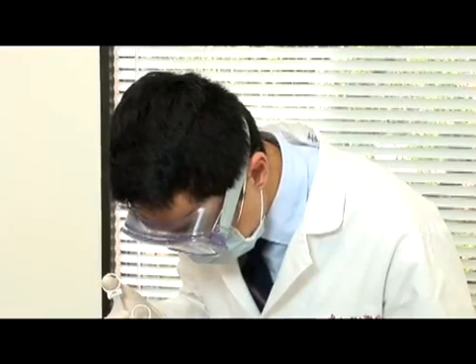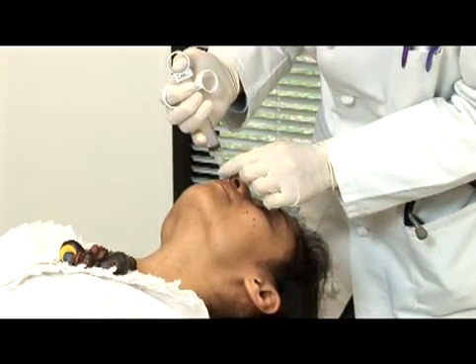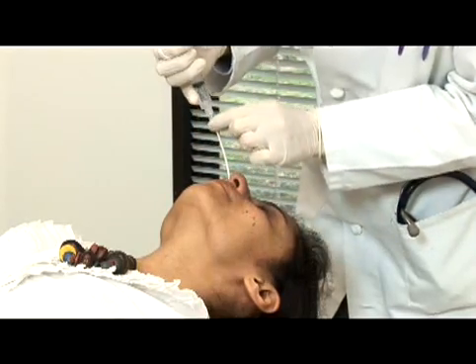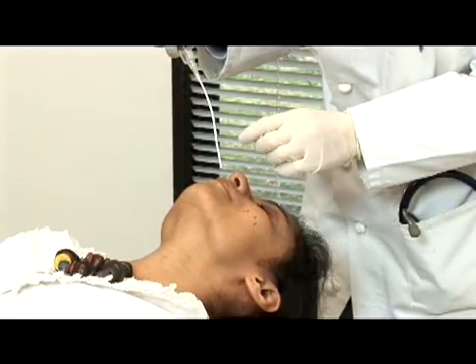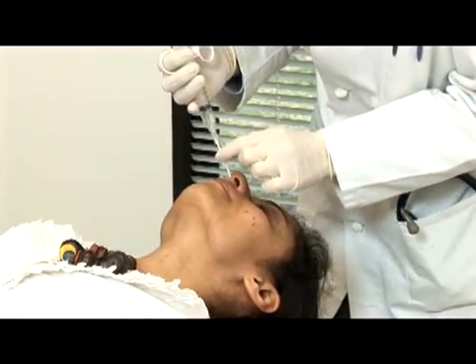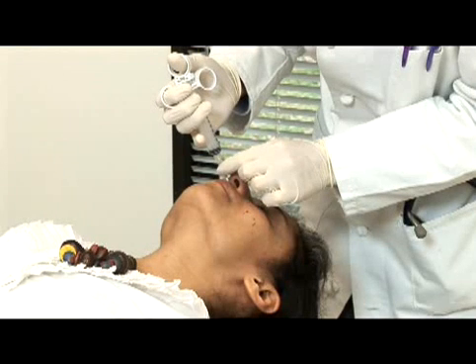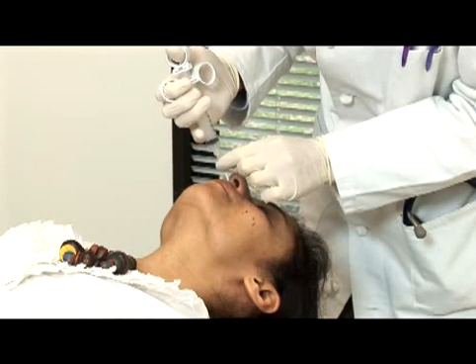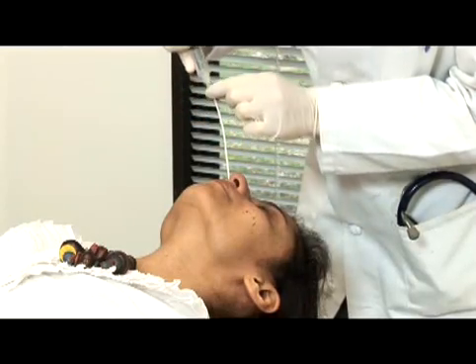Using a smooth motion and without moving the tube, quickly push and then pull the syringe plunger to expel and aspirate the saline. This must be done quickly to prevent the fluid from draining down the patient's throat. If you feel resistance while aspirating, the tube might be suctioned against the wall of the nasopharynx. If this occurs, retract the tube very slightly and then continue withdrawing the saline solution by pulling back on the plunger.